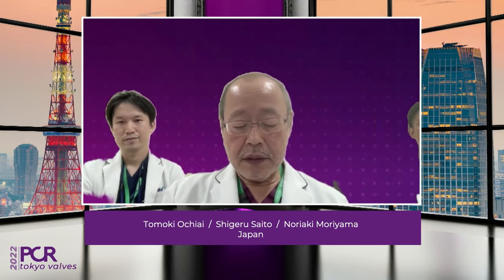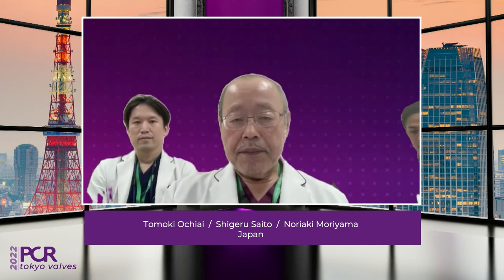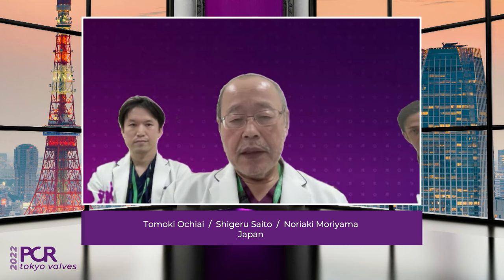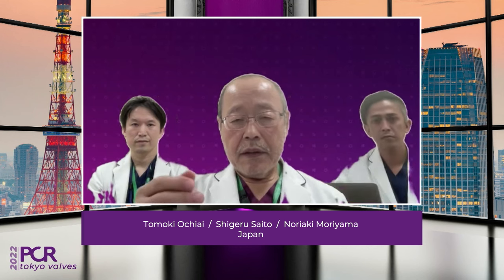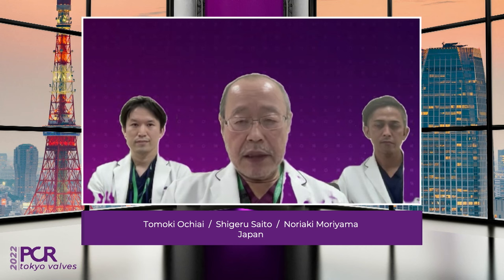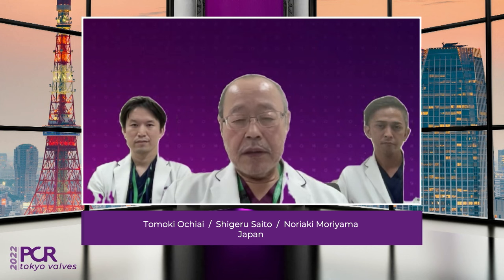Okay, thank you very much for introducing this case, Tomoki. So let's start the discussion for this particular case. First of all, who are the patients at risk of early valve failure? Because even after placing a THV valve, some valves show early degeneration. So I think young age or renal disease have a big impact on early degeneration.